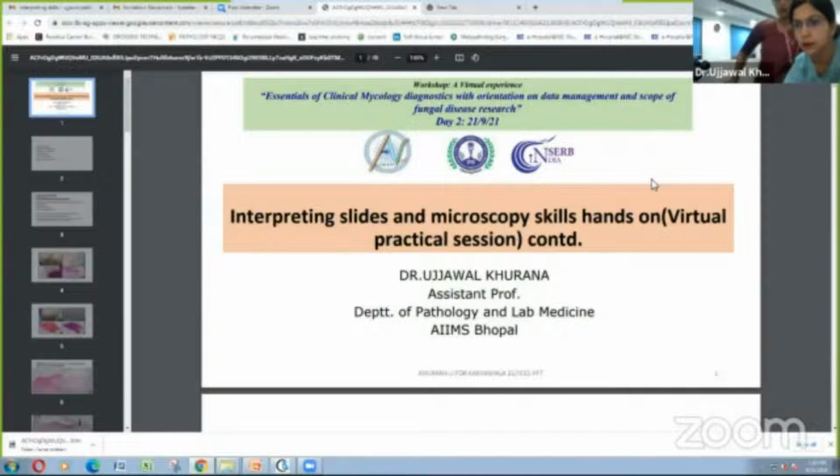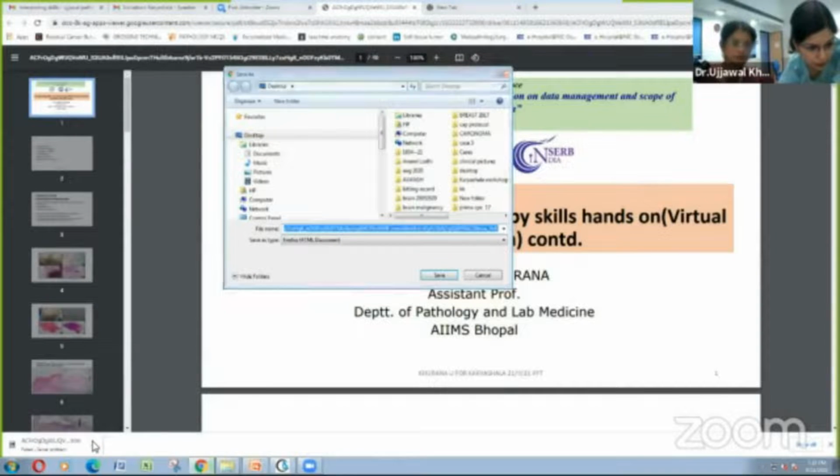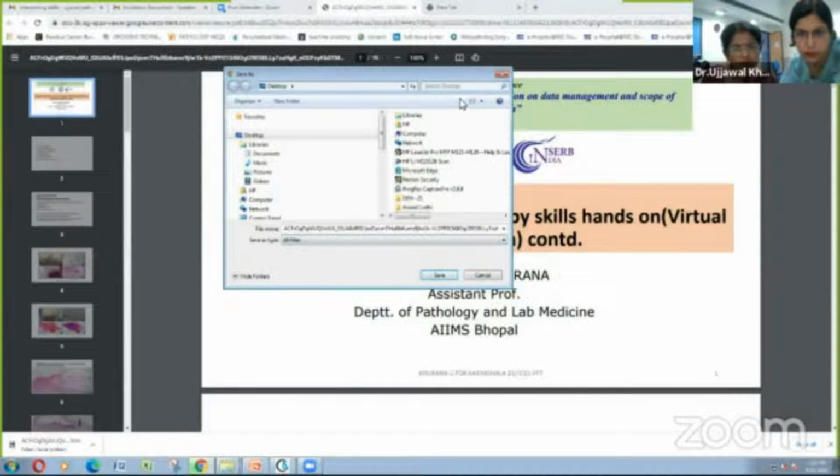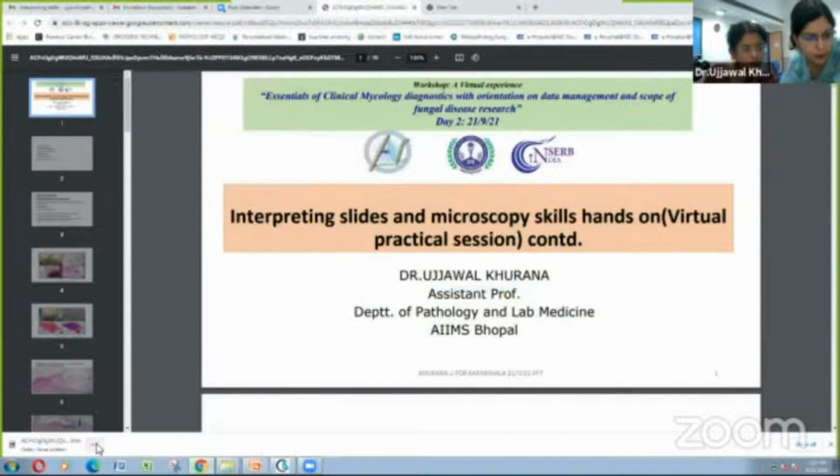Dr. Tanya has been very swift and hassle-free in juggling between the microscope and the computer screen. I hope I can also do some justice to all this. So I will be taking you through these cases.